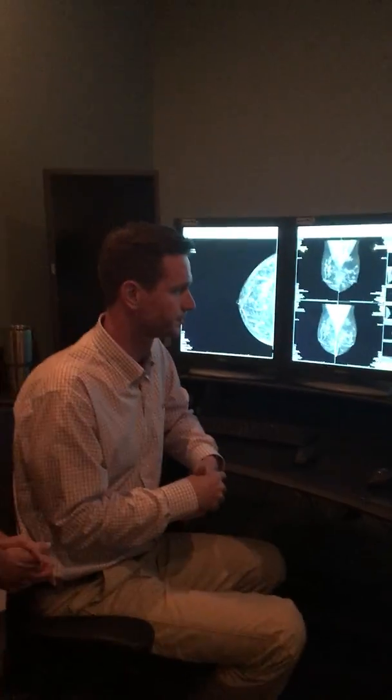One thing you mentioned was microcalcifications. What are they? Well, I can backtrack a little bit. Calcifications are the same calcium we have in our teeth, we have in our vitamins, we have in our bones. Very often, calcifications are deposited within the breasts. Almost always, it's benign. It's not cancer. The list of things that cause calcifications in the breast is very, very long, and cancer is one of the things on the list. Now, a lot of times we can look at the mammograms and know right away, is it benign, is it malignant? Most of the time.